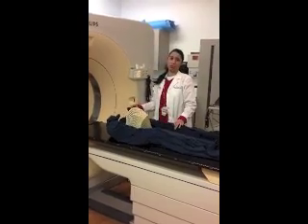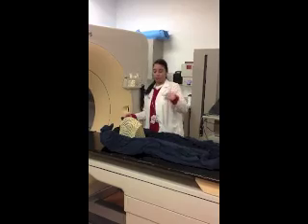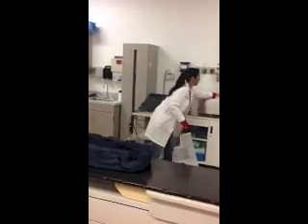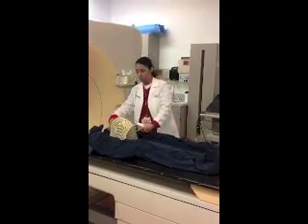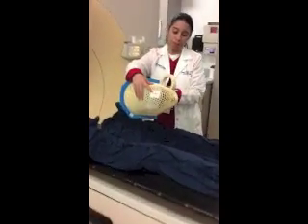The isocenter is a three-point landing that they will use to localize for the treatment of the patient. For doing such a thing, they'll use tape and any kind of marker. And then they'll put the marks on the aquaplast mask just as you see here.